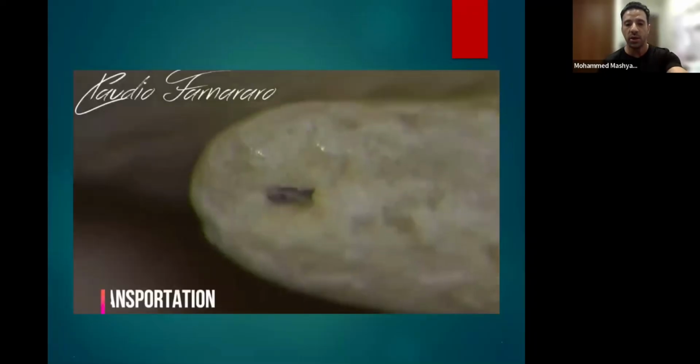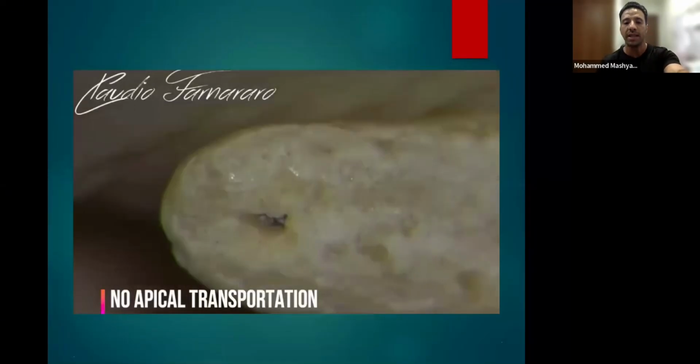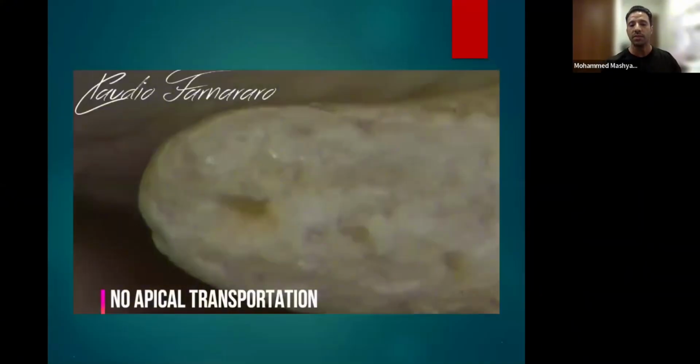I don't know, is everybody seeing the video clearly? See the apical part? He already passed the working length. Normally the working length should be inside, but this is just to be safe. So getting out a little bit, 1 millimeter out of the root canal system, you will never do a ledge inside because you are already outside, okay?